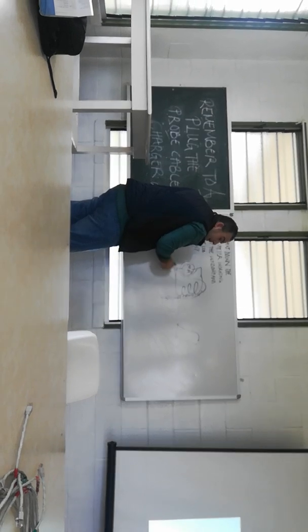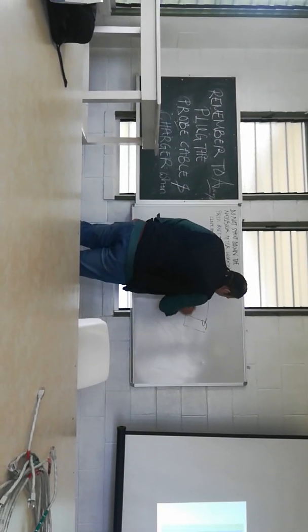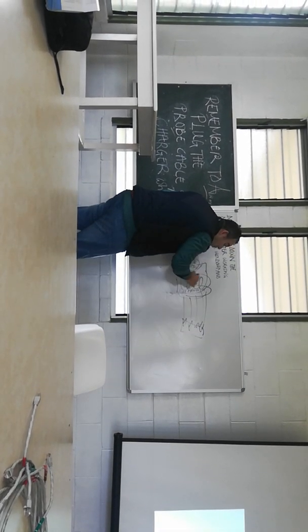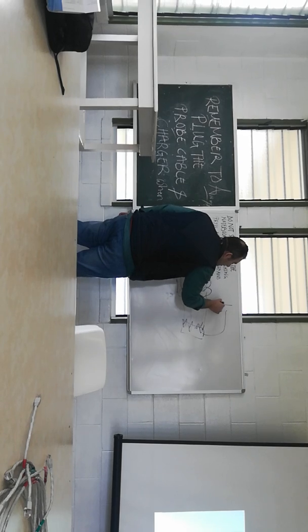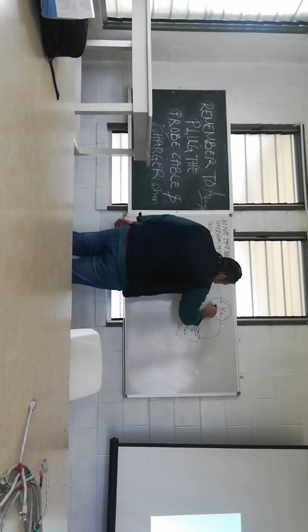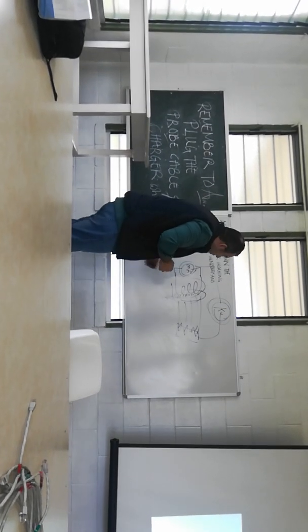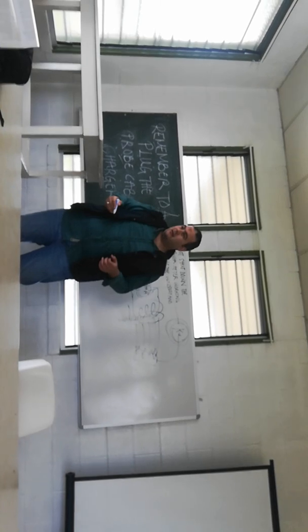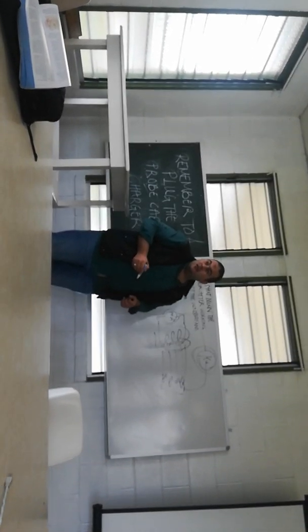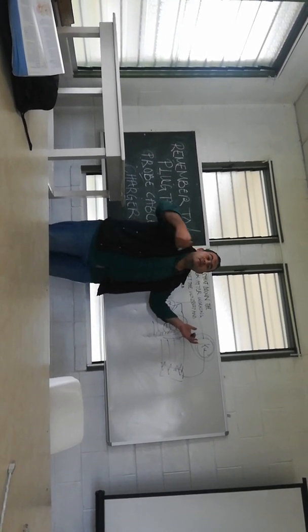So you need to move these electrons from cathode to anode. To accelerate these electrons, you need kV. This kV, or potential difference between anode and cathode, is important for acceleration of the electrons from cathode to hit the anode. This acceleration increases when the kV value is increased.